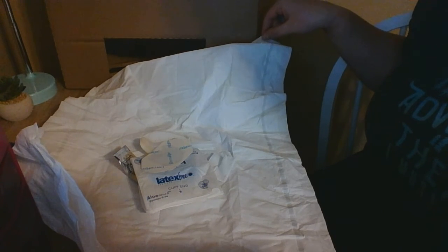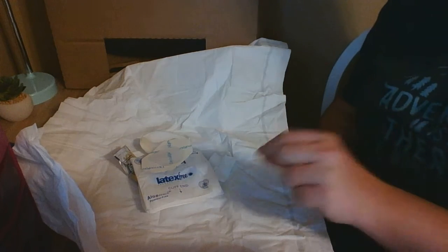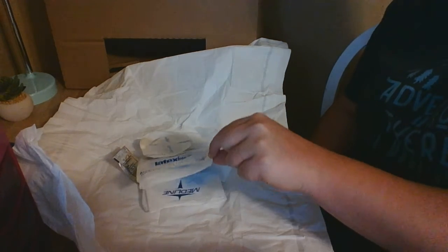So then you can see I have my sterile gloves at the top, so I'm just gonna grab those and put them on my side table, so I can put those on. I'll just turn it.